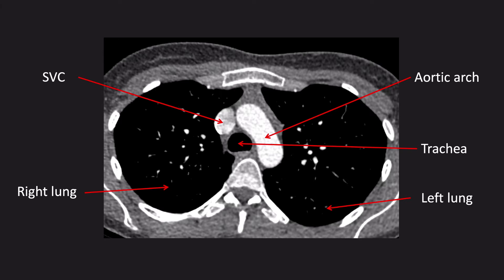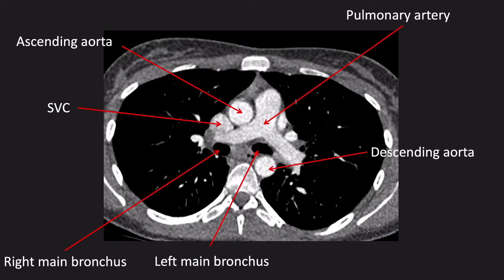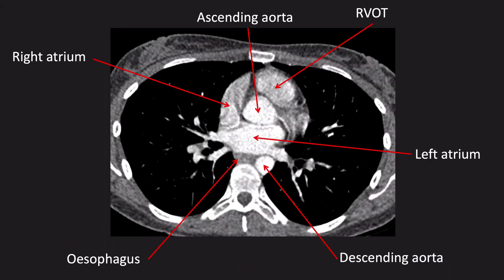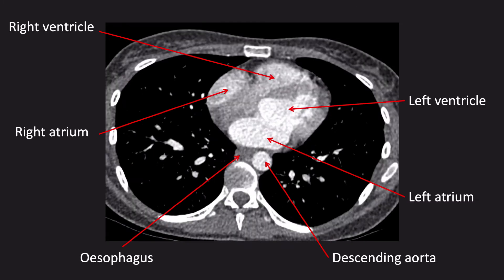Now I'm going to run through some cross-sectional anatomy. Starting in the superior mediastinum, we have the aortic arch and on the right, the superior vena cava with the trachea posteriorly. Moving down below the level of the aortic arch, we can see the ascending aorta anteriorly and descending aorta posteriorly. In between the two is the main pulmonary artery branching into right and left pulmonary arteries. The trachea splits into the right and left main bronchi at the carina. Coming into the heart, we can see the aortic root just above the level of the aortic valve and the right ventricular outflow tract running into the pulmonary artery. The left atrium is the most posterior cardiac chamber, linking to the left ventricle via the mitral valve. The right ventricle is the most anterior chamber and is linked to the right atrium by the tricuspid valve.